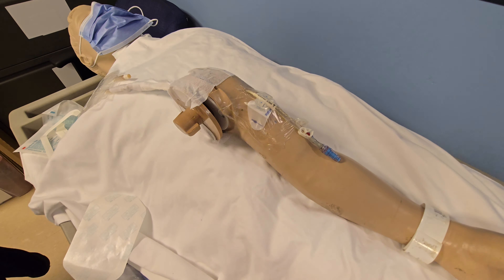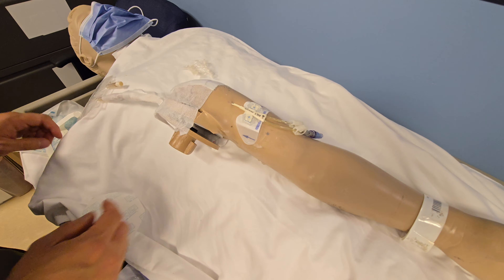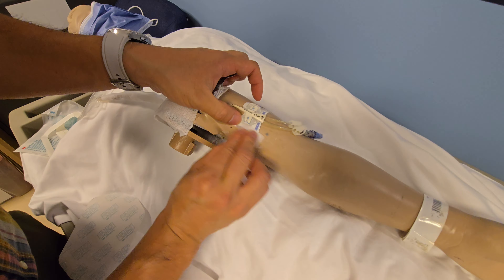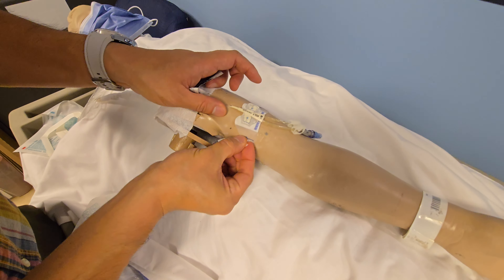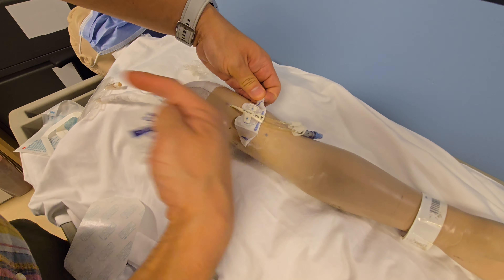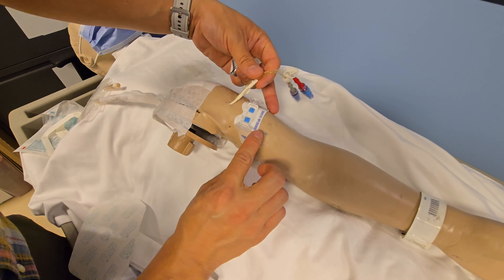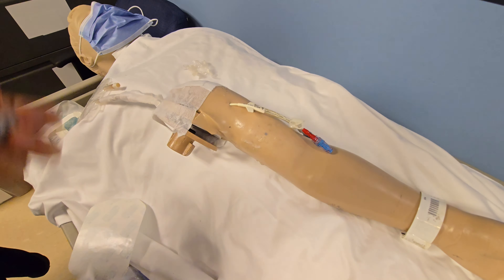This is the stat lock. To remove it, we start by removing the transparent Tegaderm Firm. If the wings don't come off very easily, grab a little piece of alcohol swab. Once you moisten the wings with alcohol, they will peel off from the skin much more easily. Always remember when you remove any securement device, pull it towards the patient — because you don't want to pull it away and have your PICC line migrate outwards. Open one side, open the other, take out the PICC line, and use alcohol if it becomes too sticky. That is the stat lock.